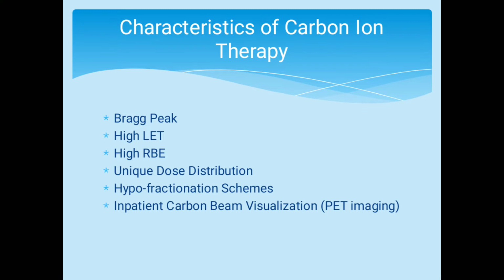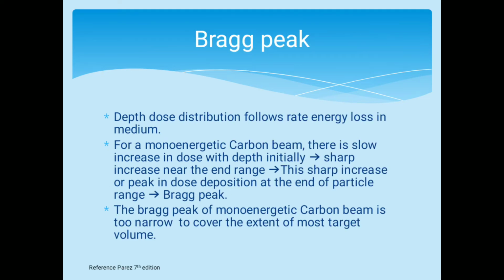These are the characteristics of carbon ion therapy: Bragg peak, high LET, high RBE, unique dose distribution, hypofractionation schemes, and PET imaging. First we will discuss about Bragg peak.